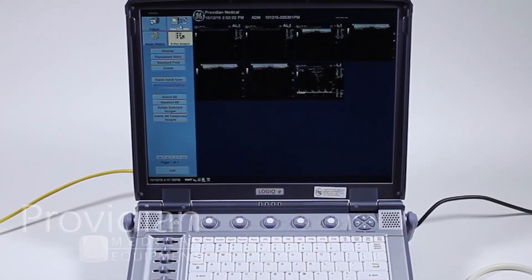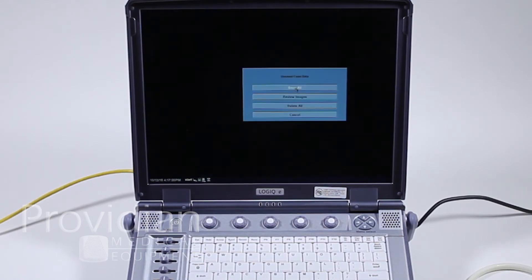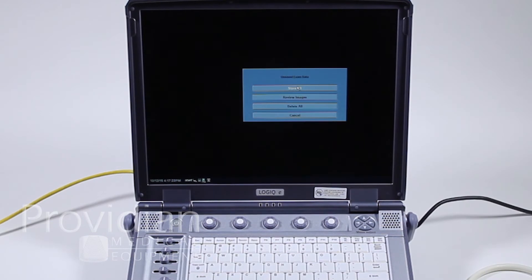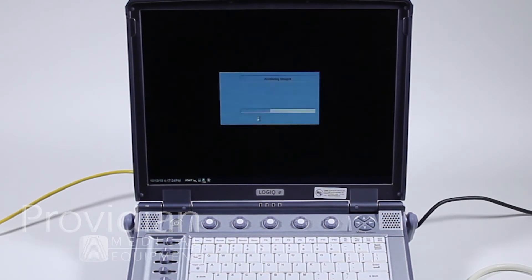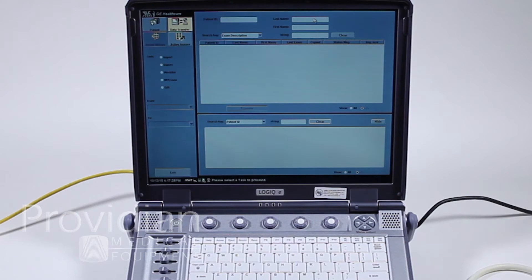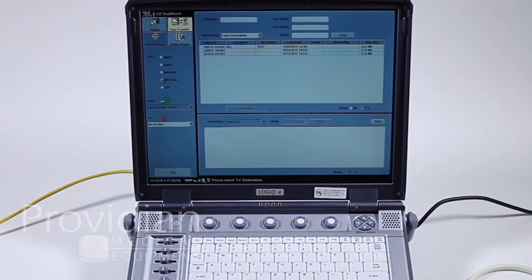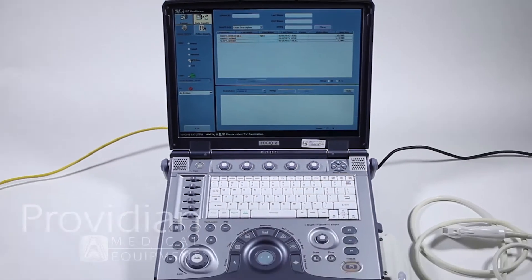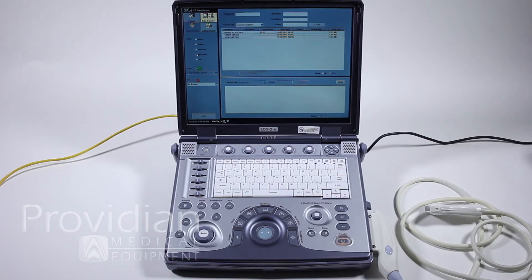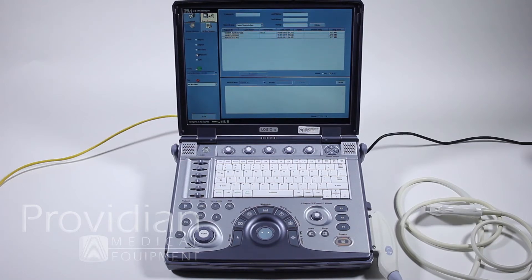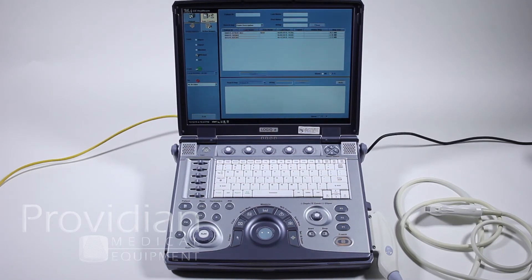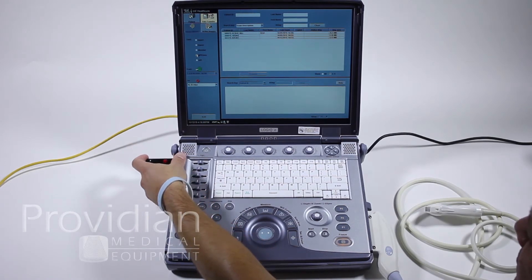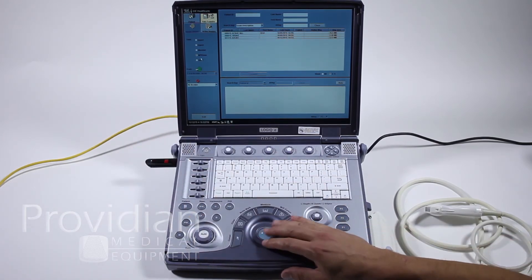Let's do this to make sure. We'll click up here to data transfer. It's saying I have unsaved exam data. I'm going to go ahead and store all. I'm going to choose MPEG view. MPEG view allows me to view this on a PC. It will install software onto your PC that allows you to view all the images and cine loops in a web browser, and it's quite handy.